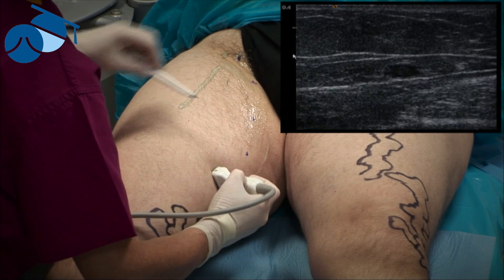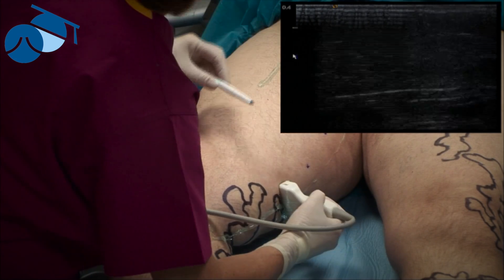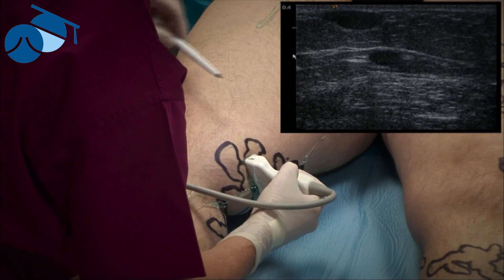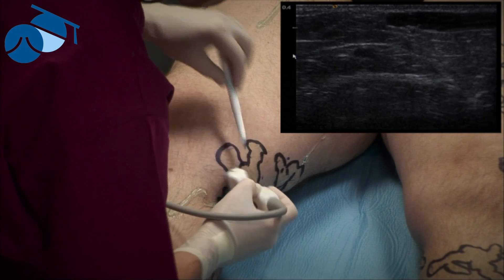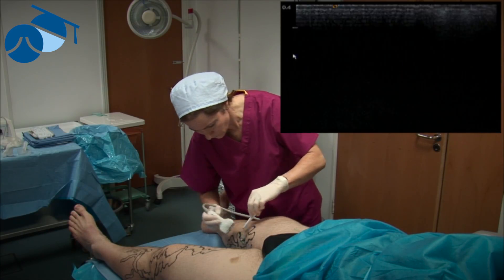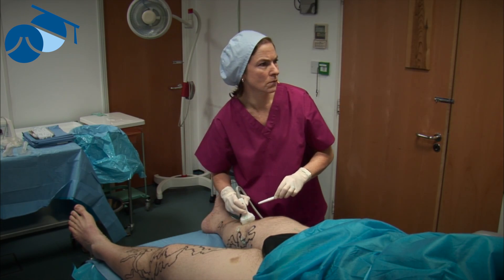The vascular technologist is also checking that the lumen is open so the device can be passed up easily, and that the vein is staying within the saphenous fascia. There's a tributary coming off — that doesn't matter for endovenous surgery. What would matter is if the great saphenous vein itself appeared to come out of the fascia and become more superficial. What actually happens is the great saphenous vein becomes atrophic and a side tributary comes out, though people do perceive this as a superficial section of the great saphenous vein.